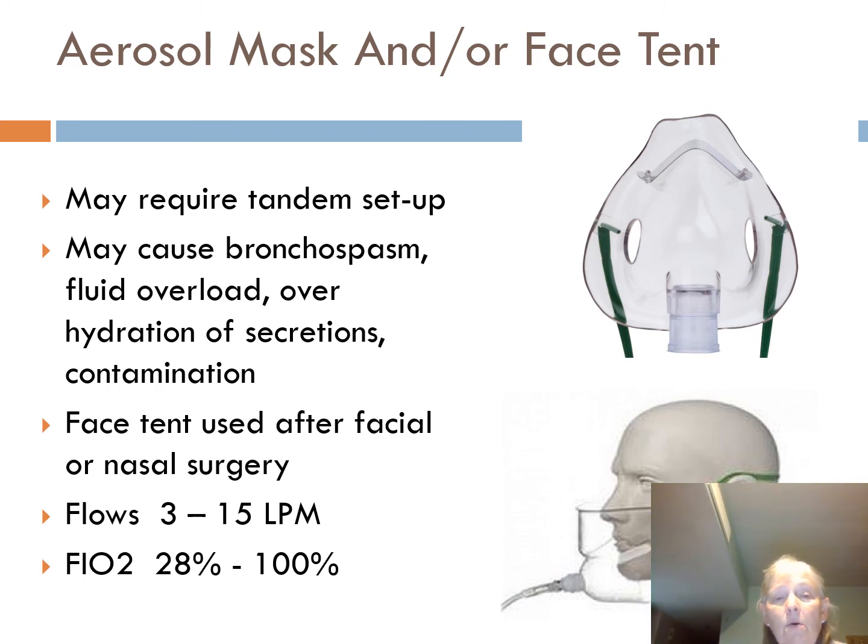They may set them up other places, but we're not. So these may require the tandem setup. They can cause bronchospasm, fluid overload, overhydration of secretions, contamination, because they're connected to water. And anytime you start talking about water, you got to be concerned about that, okay? We also have a trach mask. It's not on here, but it's a mask that actually fits over the patient's trach and has the same cautions and everything that we see with the aerosol mask.